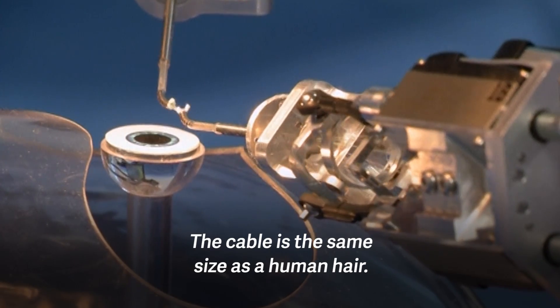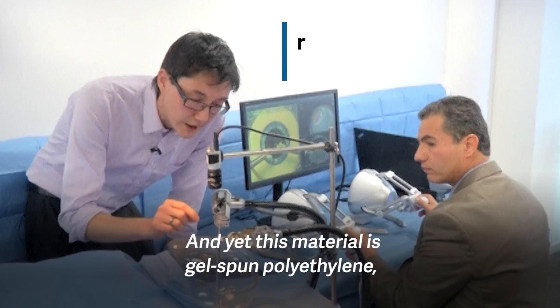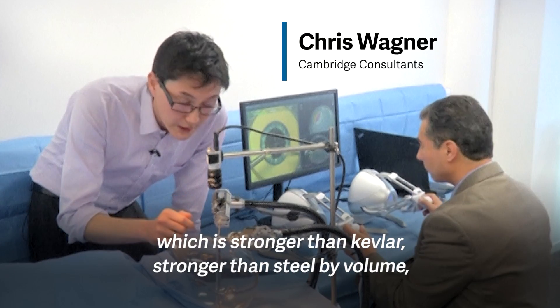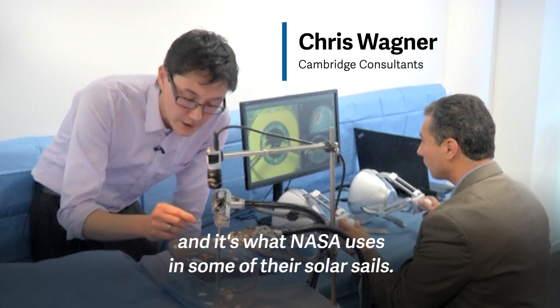The cable is the same size as a human hair, and yet this material is gel-spun polyethylene, which is stronger than Kevlar, stronger than steel by volume, and it's what NASA uses in some of their solar sails.